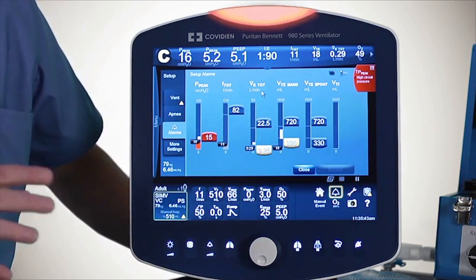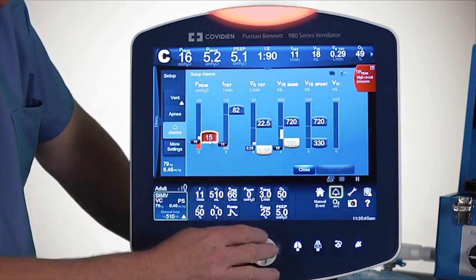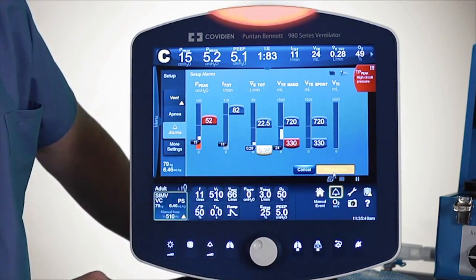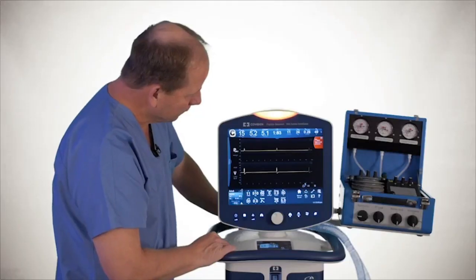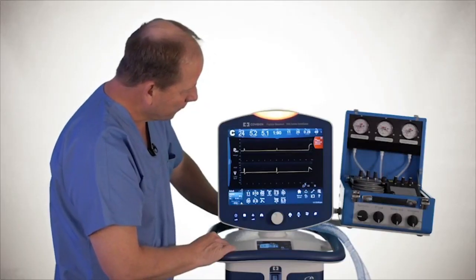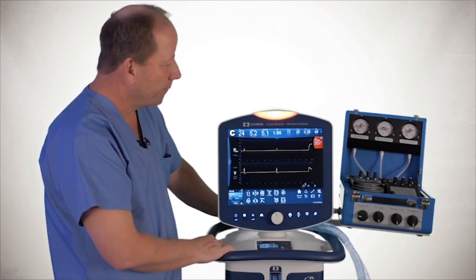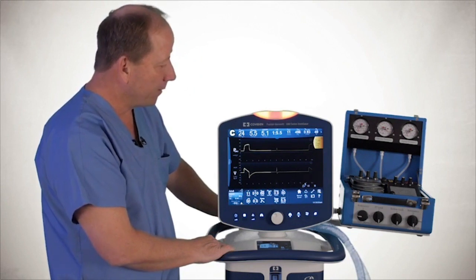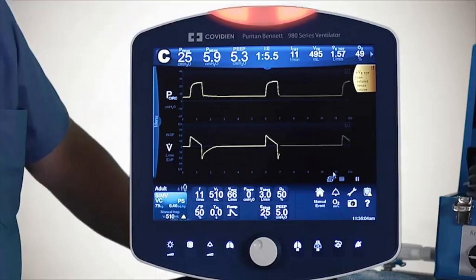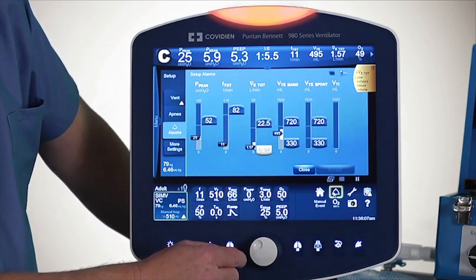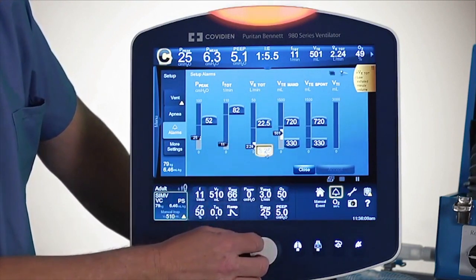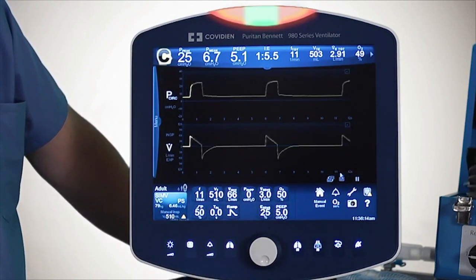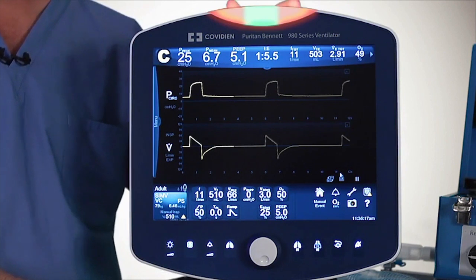Now I'm going to go ahead and reset that alarm. Once the alarm is reset — just one more moment here — make sure I've got all the alarms reset.